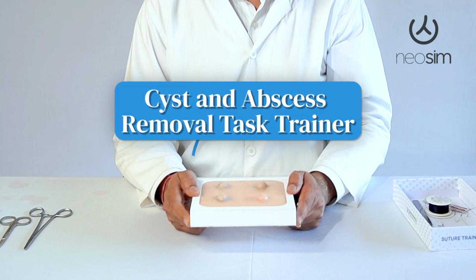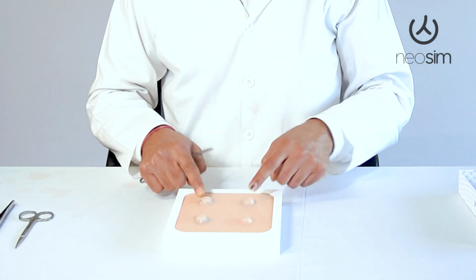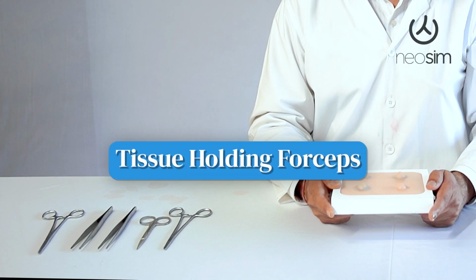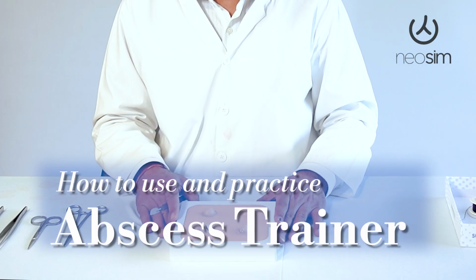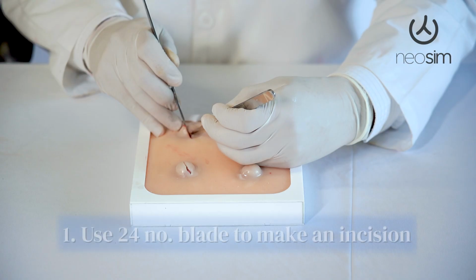First, have a look at the articles which are needed for this procedure. We need a cyst and abscess removal task trainer. These two are for abscess drainage, and these two are for cyst drainage. We also need a suture needle, suture silk thread roll, artery forceps, tissue holding forceps, sharp scissors with a surgical blade, and a surgical handle.